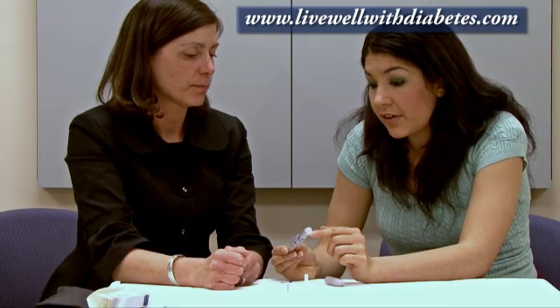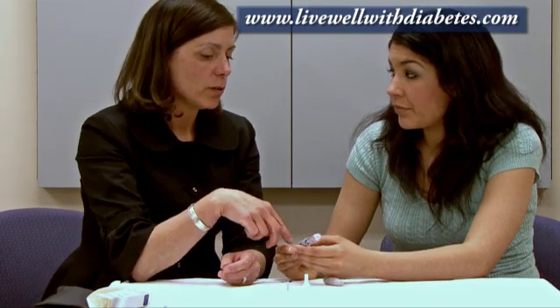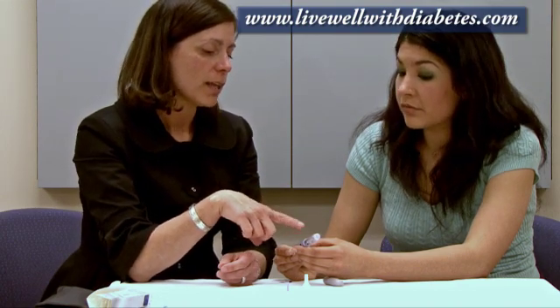With new packages you keep it in the fridge, but once you start using it, can you return it back into the fridge? Once you start to use this pre-filled pen, it is stable for 28 days out of the fridge, so you shouldn't put it back — you can leave it out as long as it's not in direct sunlight or left in a really hot car. Any pens you're not using: when you get these from the pharmacy they come with five pens in a box, so the other four pens you're not using all get kept in the refrigerator.